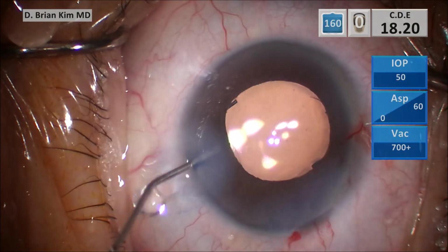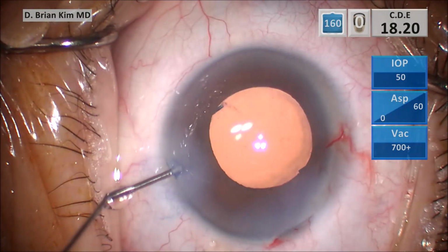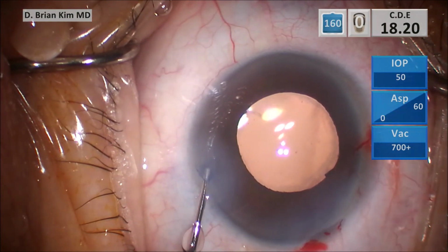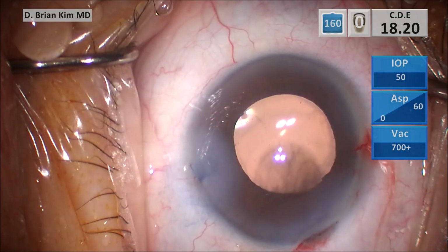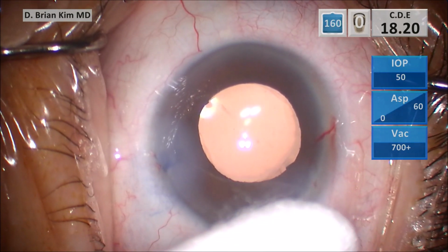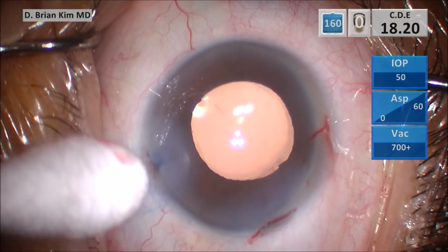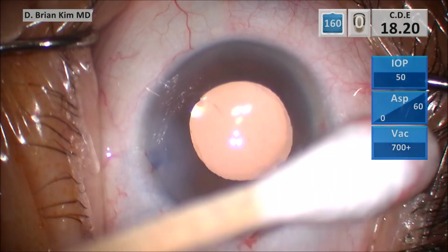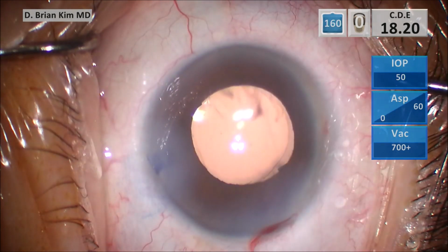And so if you are curious about your techniques, you could do exactly what I did. Put some dispersive viscoelastic to coat the corneal endothelium, and then put a few bubbles in and see if you're able to retain those bubbles that are mixed with the viscoelastic. If you find yourself struggling to keep the bubbles in the eye throughout the entire case, that is an indication that you have trouble keeping the corneal endothelium protected with viscoelastic, and this explains why you have corneal edema, even though you felt like you did a safe surgery.